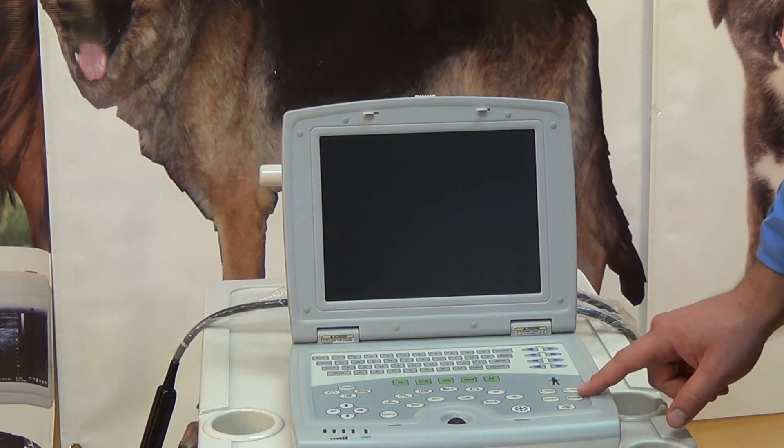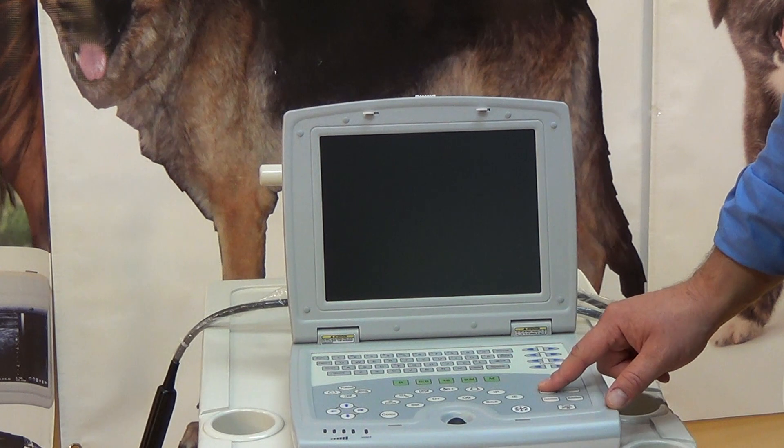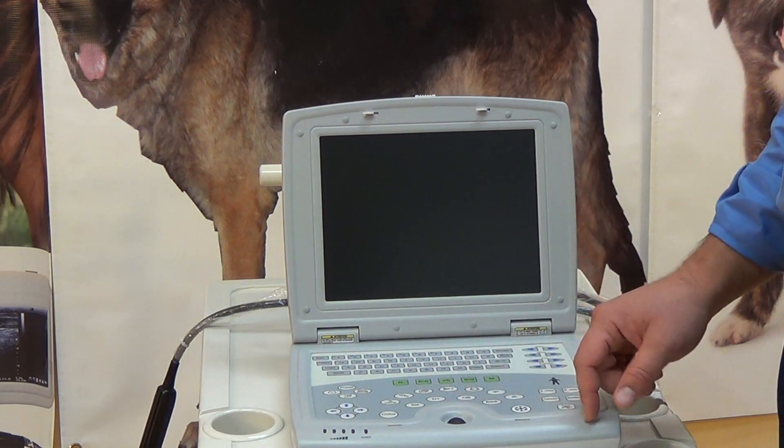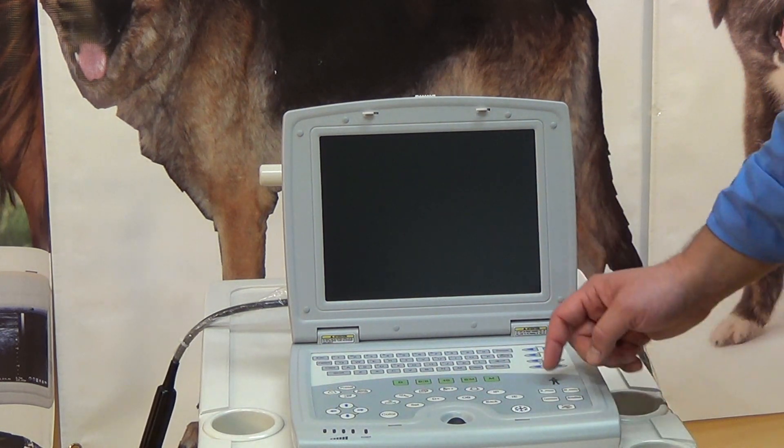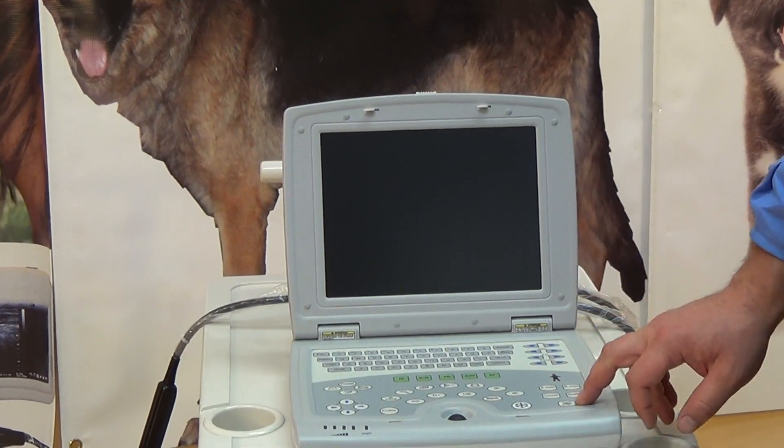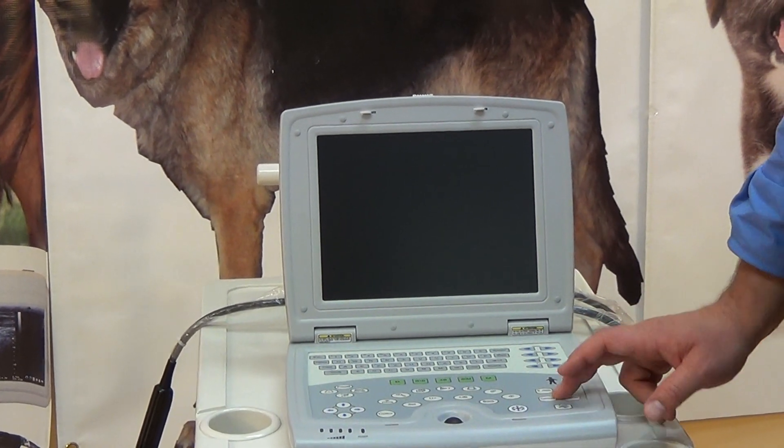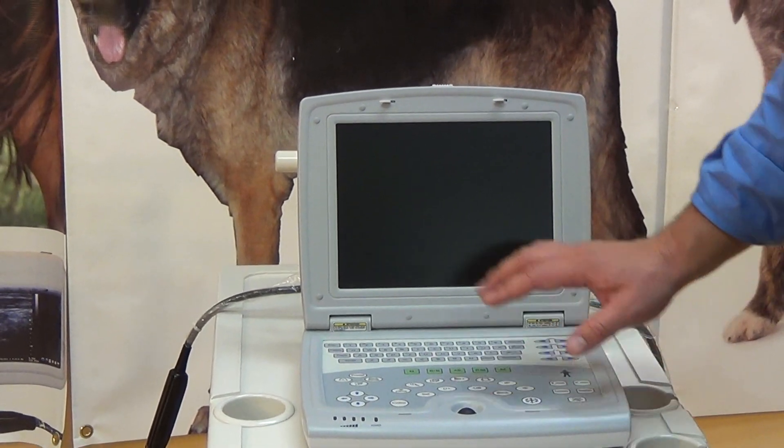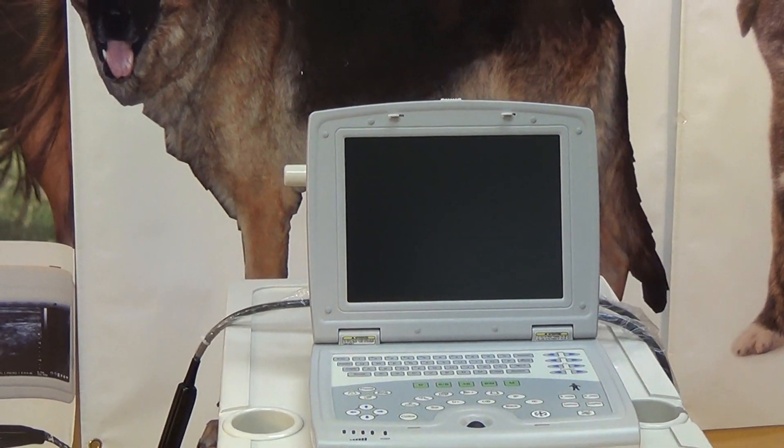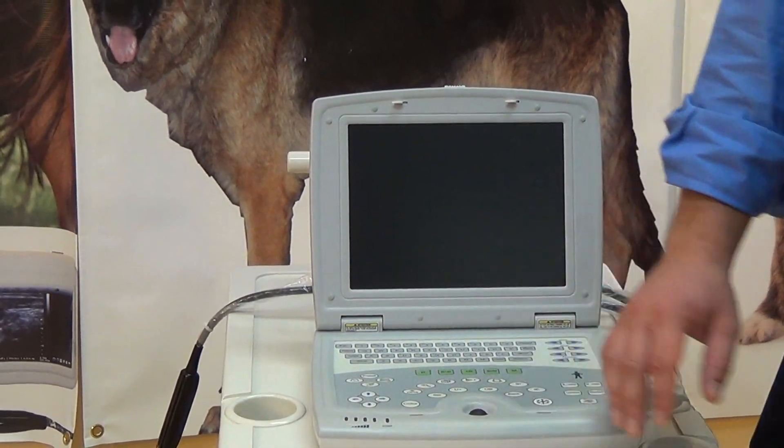And then we have our basic measurements. So basically hit the B mode, set one point, set the other, and it comes up as measurements. And that's for both B mode and M mode. And then finally is the comment button that's also self-explanatory. You hit it, you set where you want to type, and then hit again, and then you're out.